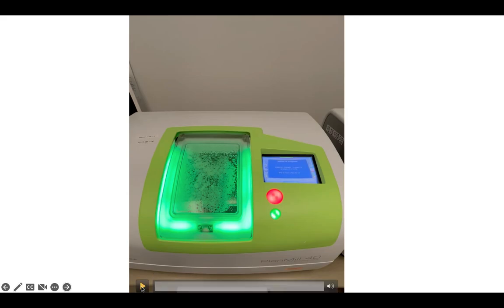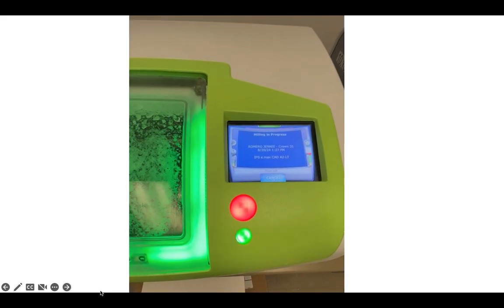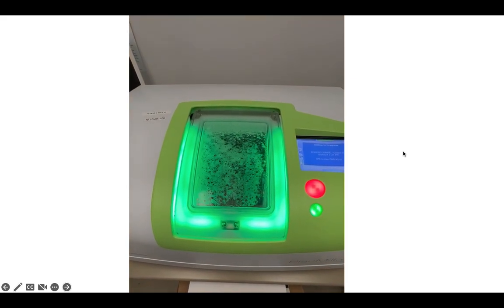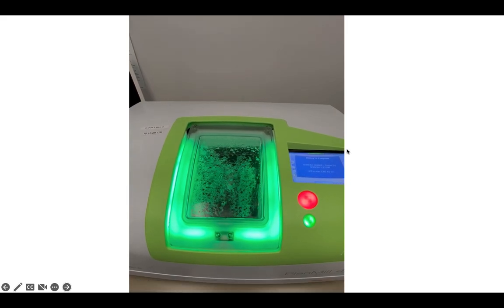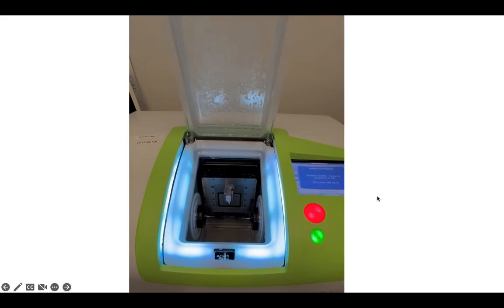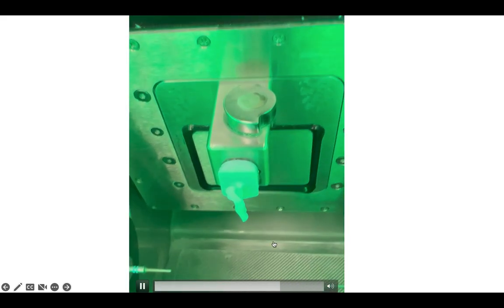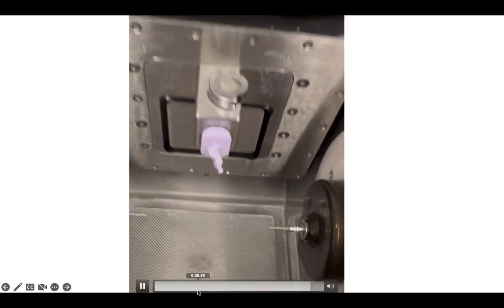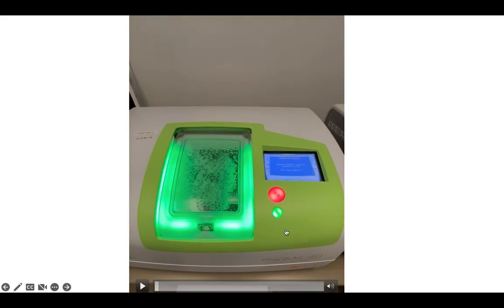I have here a video so that you can see a little bit of what it means and the noise that it makes. So you will have here the name of the patient. Well, we have a little glitch right now going on that we don't have the name of the patient, but it used to be like that. Observe here, this is the little block, and those are the burs. Something that is curious is that this machine, the old one, has 2 burs, and the new one has only 1 bur.